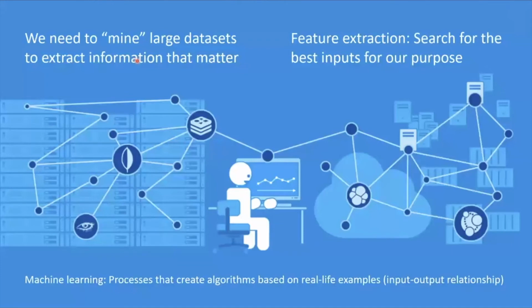But now that, at least in the case of Hexoskin, we have all of these variables extracted from the raw signal, we have to define which of them we are going to use to teach a given machine learning model to predict something that matters from a clinical perspective.